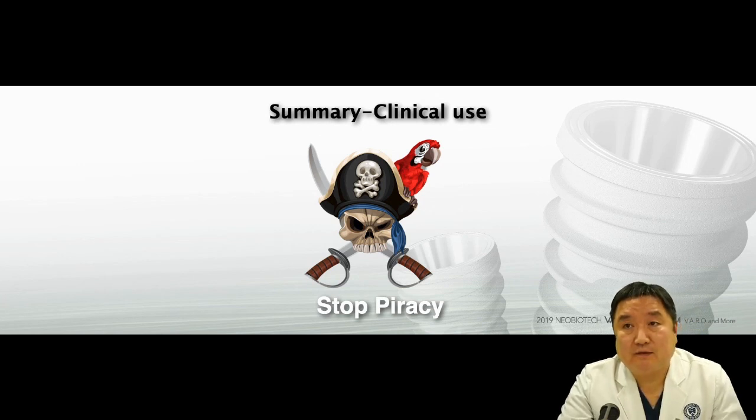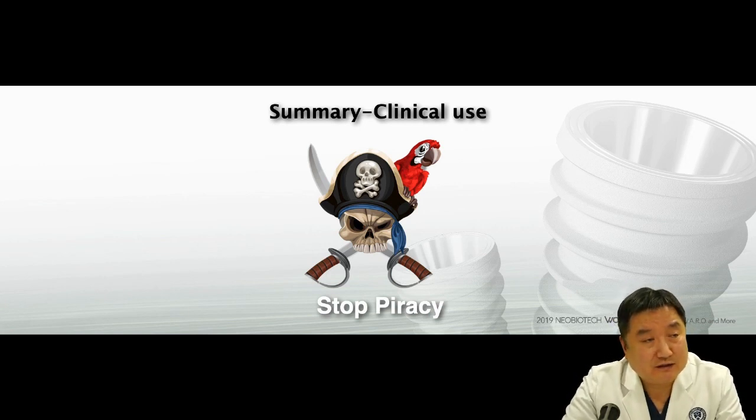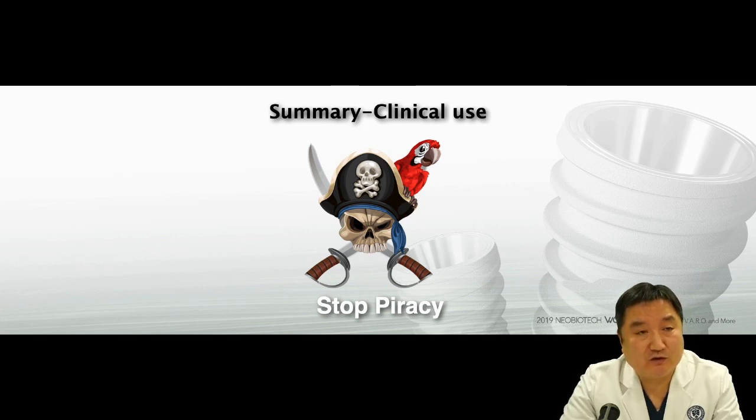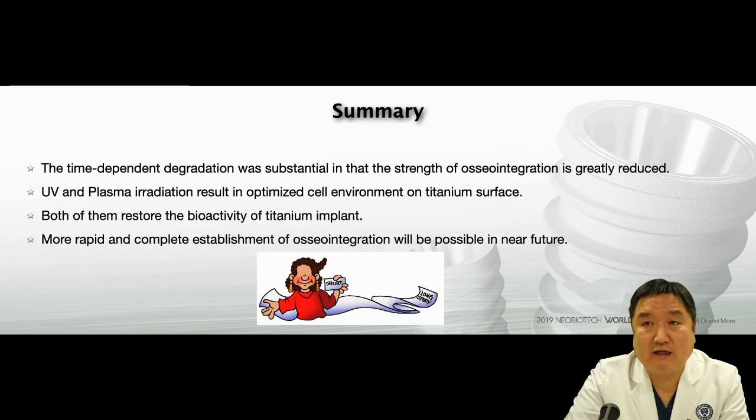So again, the photofunctionalization process will rejuvenate your aged implant surface, but when you use it, you should be very careful which one to use. So I'd like to wrap up my presentation with a summary.